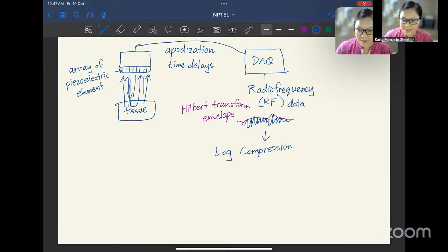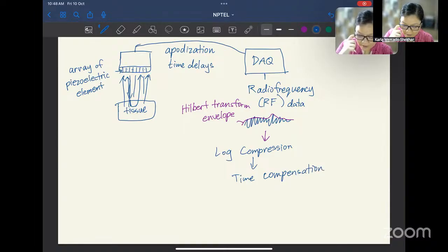And in ultrasound, that's useful to visualize the backscatter from even the smallest structures. So you do log compression. And post-processing on the receiver side, you can have time gain compensation, which I mentioned earlier. In your data acquisition, you have beam forming, or it depends on the sequence you want to do, right? So you can have beam forming even from radio frequency data happening here.